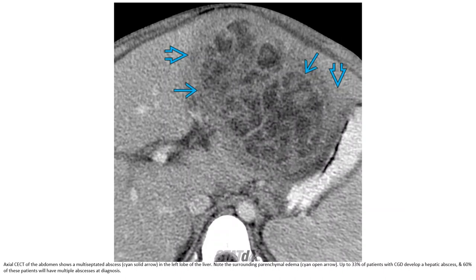Contrast-enhanced CT of the abdomen shows a multiloculated abscess in the left lobe of the liver. Note the surrounding parenchymal edema. Up to 33% of patients with chronic granulomatous disease develop a hepatic abscess, and 60% of these patients will have multilocular abscess at diagnosis.